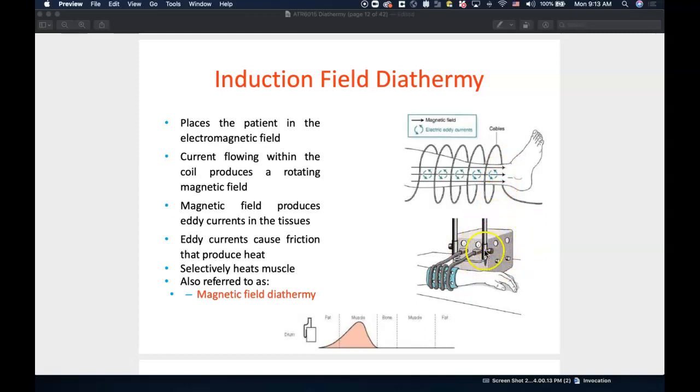It's hooked up to an electromagnetic box. You're going to have some kind of electromagnetic padding, and then the coils will wrap around that to protect the patient, right? In other words, we don't want to apply the coils directly to the patient. And so we get this electromagnetic field going as we turn on that energy. And so we can see we have eddies of current flowing through the patient's injured area with the goal to restore homeostasis within that injured area. Does that make sense, you guys?